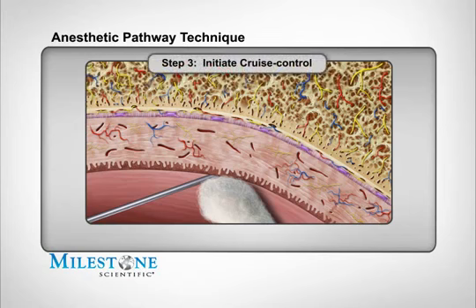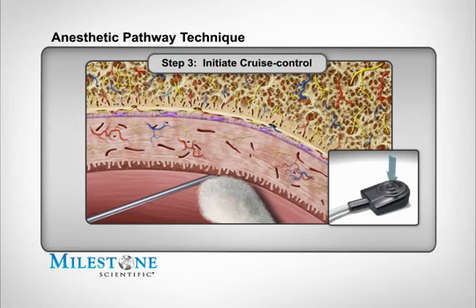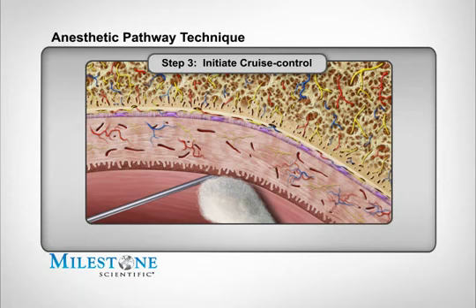Step 3: Initiate cruise control by depressing the foot pedal and counting three audible beeps. After the third beep, the STA system will announce the word "cruise." Upon hearing this announcement, remove your foot from the top of the foot control pedal. You will find that the STA system will continue to beep, indicating anesthetic solution is continuing to flow. The technique of allowing anesthetic to contact and diffuse through the outer layers of tissues produces a topical anesthetic effect, numbing the surface.